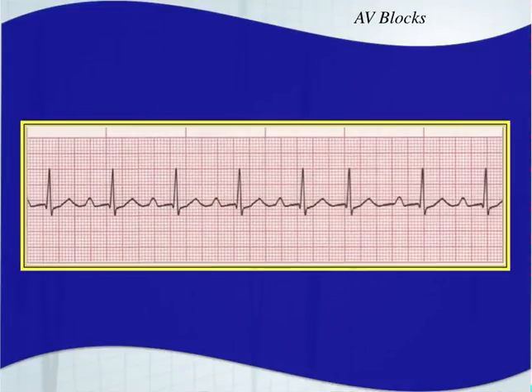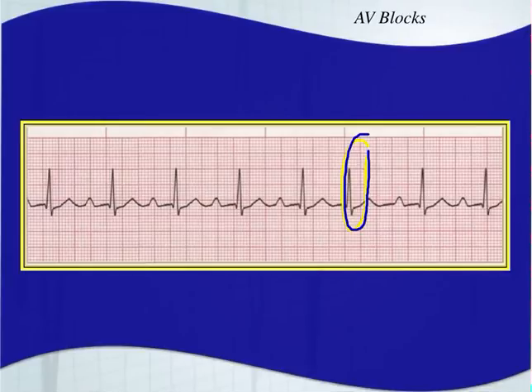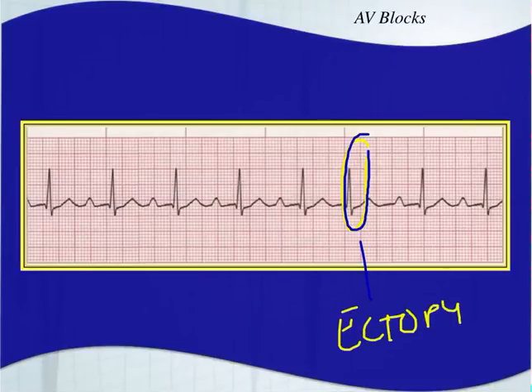Looking at another example: we have a PR interval of constant length and no dropped beats. However, there is an extra beat — that is ectopy and has nothing to do with the underlying rhythm. This is a normal sinus rhythm with a first degree AV block. We'll go over ectopy in a future chapter.